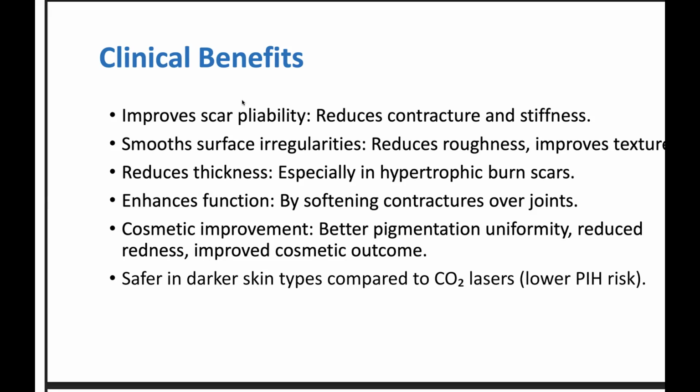After laser treatment, we will observe better pigmentation uniformity, reduced redness, and improved cosmetic outcomes. In patients with dark skin types, such as in Asia or in Africa, it's safer to use the Erbium laser compared to the CO2 laser. Next.